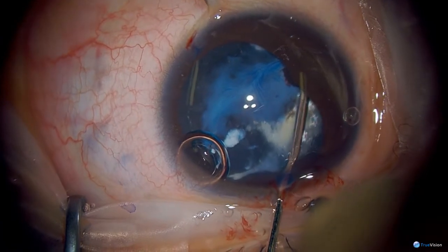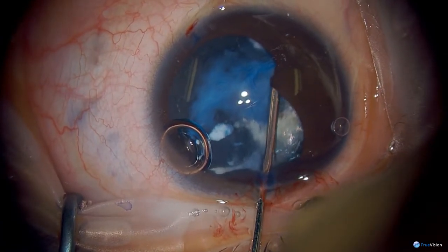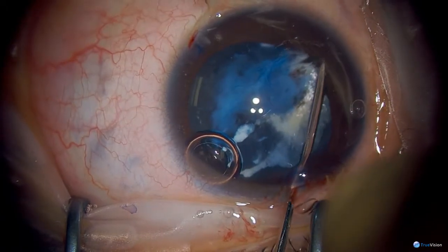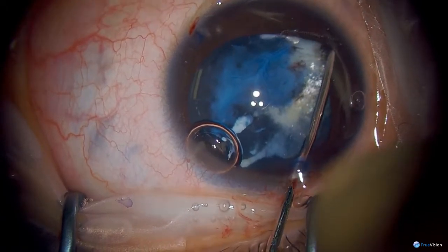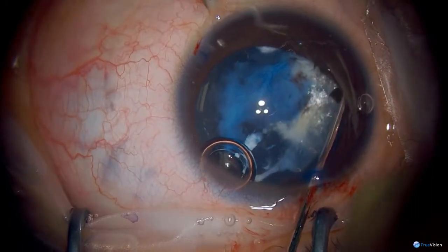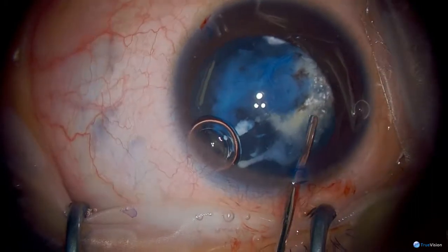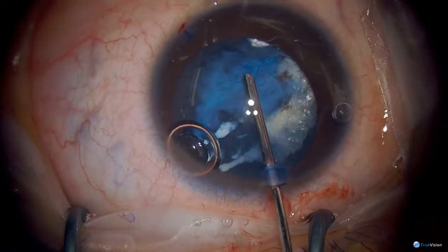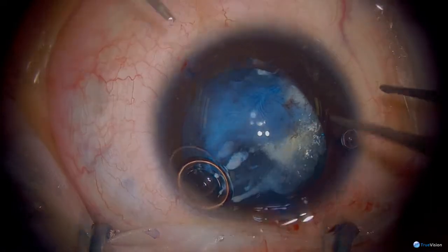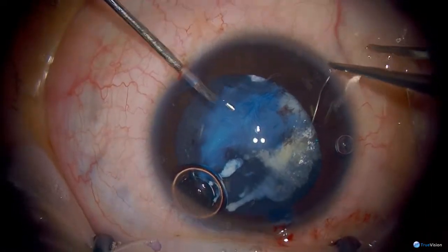Because we're going to be placing this lens in the sulcus, I just want to make sure that the entire sulcus is free. Because otherwise, if there are any adhesions, what ends up happening is the lens can become decentered. So I'm looking at what the spatula is doing, and I'm also feeling, and I don't feel anything there.